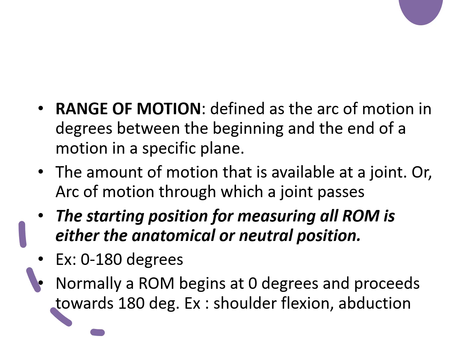I have already given you the example of shoulder abduction, 0 to 180 degrees. You start from 0 degrees of the shoulder and end at 180 degrees for shoulder abduction. Similarly for shoulder flexion, you start from the 0 degree neutral shoulder position, and then you take your arm up in the anterior direction in the sagittal plane, up and above, so that the arc is completed at 180 degrees. I hope it is clear.